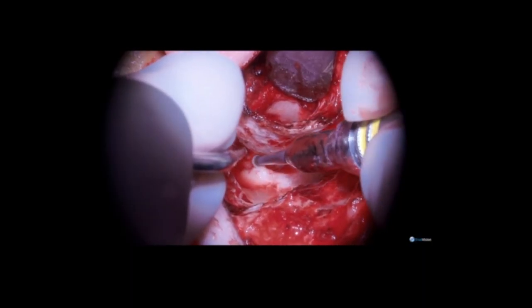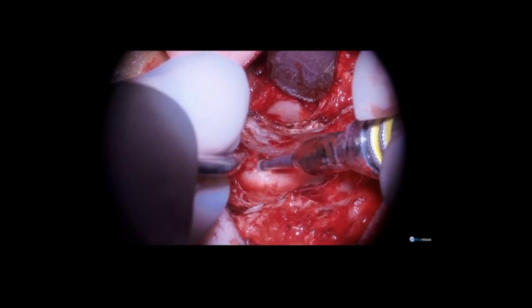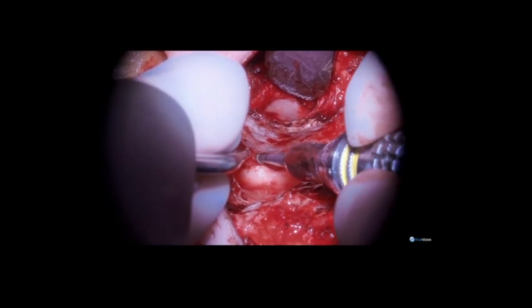Now I am taking down the knuckle of bone to smooth it to the level of the lateral semicircular canal to facilitate the view during the second stage reconstruction.